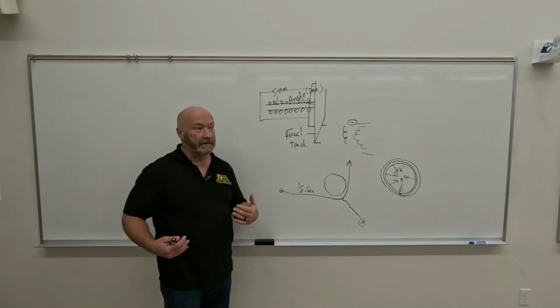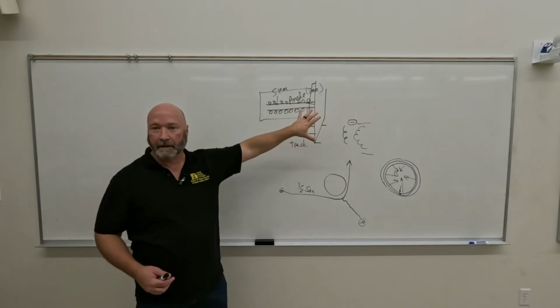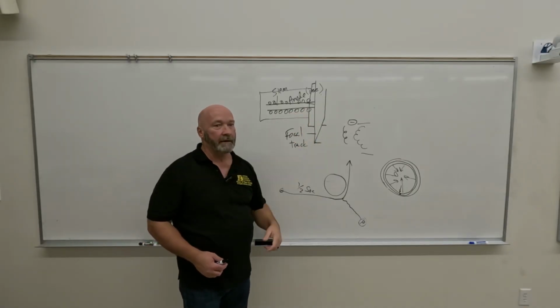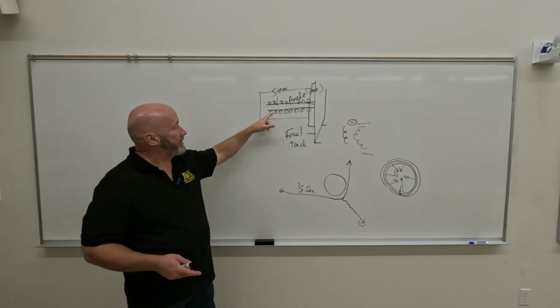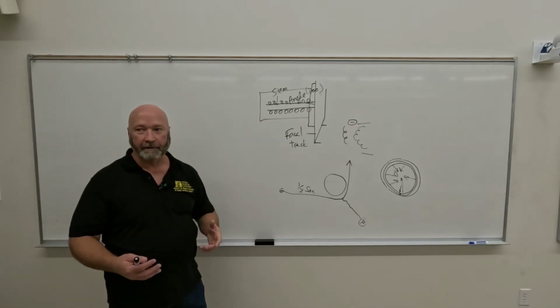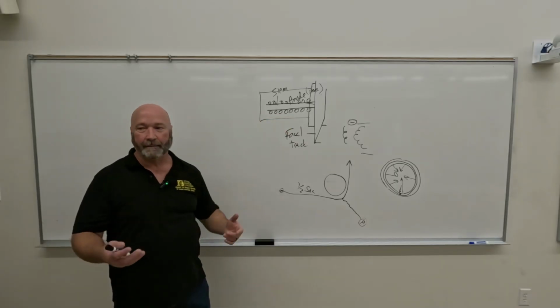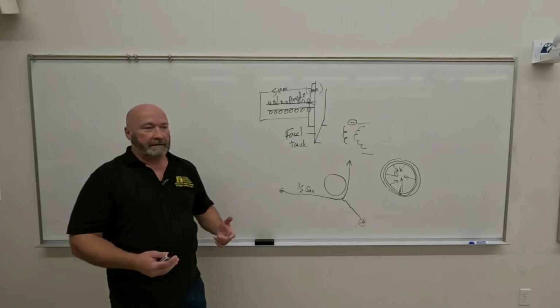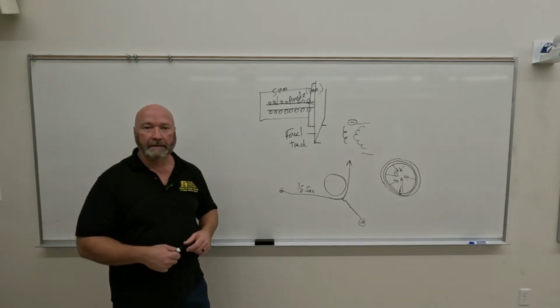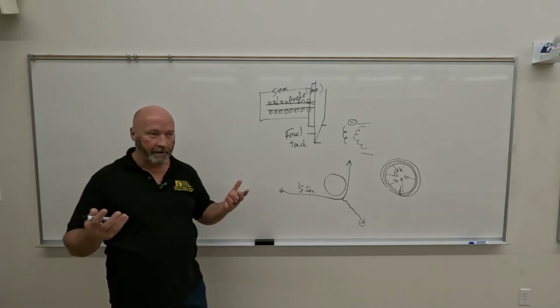It's got to go down the stem some, because this entire thing is inside of the X-ray tube, right? So you're going to get some thermal radiation down here. But the problem is these bearings, and they could be a number of different configurations. They could be ball bearings, needle bearings, any kind of bearing. They're greased to make them roll easy, and eventually that grease is going to vaporize.